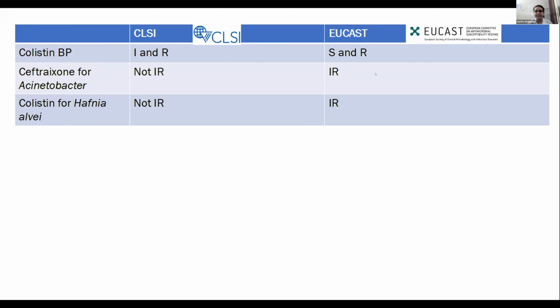Yeah. Those differences between CLSI and EUCAST are not limited to this many. For every organism, there is a list of differences. So me and Ketan and Dipasri, Haritha, we all were going through this over the last couple of weeks. We realized that differences are there at breakpoint level for every organism. However, the major ones we have displayed here, so that overall you should have an idea about the differences.